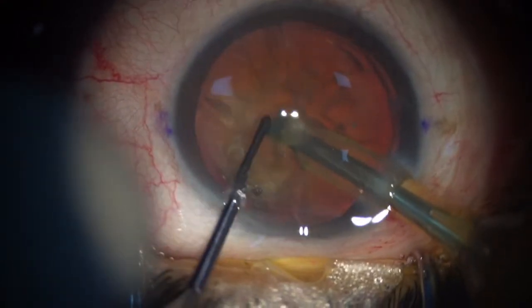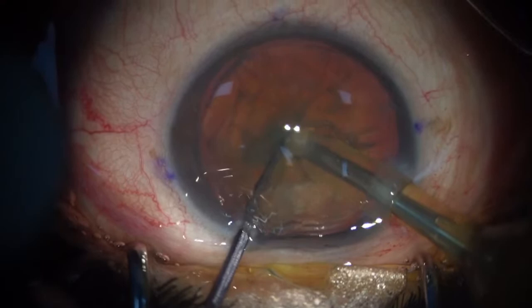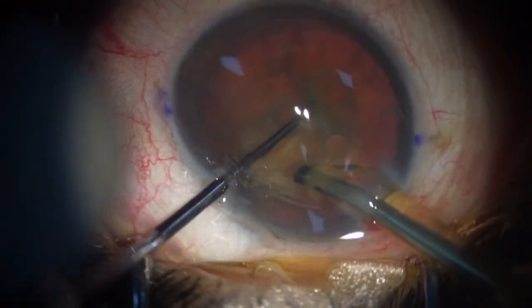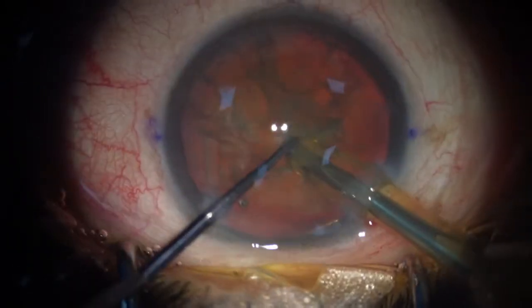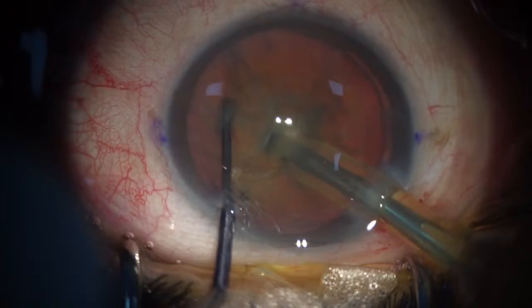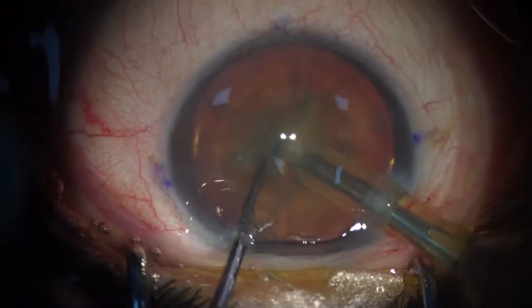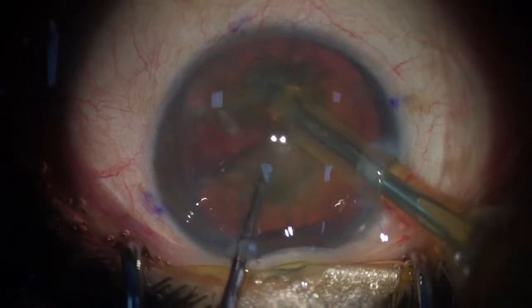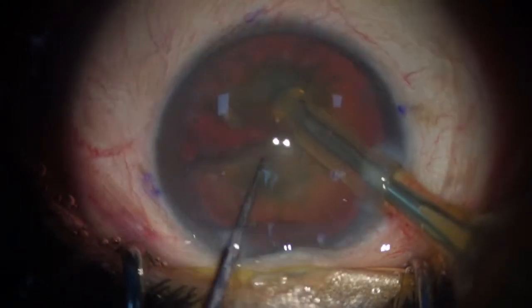So chamber stability is usually very good. This patient is myopic, so there's a deep chamber. So I am going to do a direct chop. That's what my usual technique is. And usually when you have a very deep chamber, it can be a little challenging.